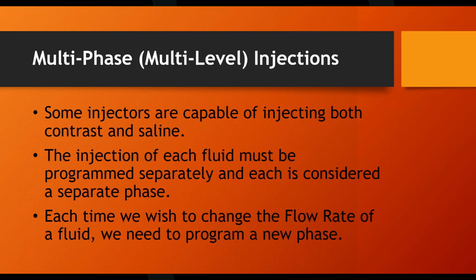So what will happen is, again, I'm going to jump ahead here. I'm going to arm my injector and I'm going to perform my injection. So right here, you see the lights flashing. That's the visual indicator to the operator that we are going to shoot a shot here.